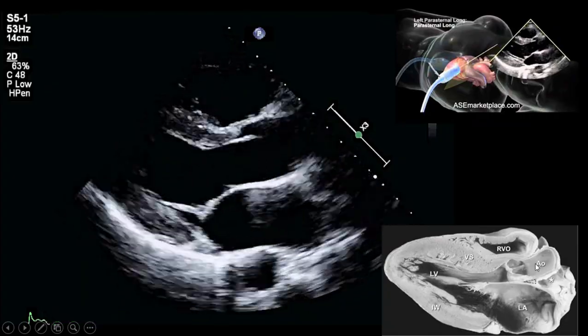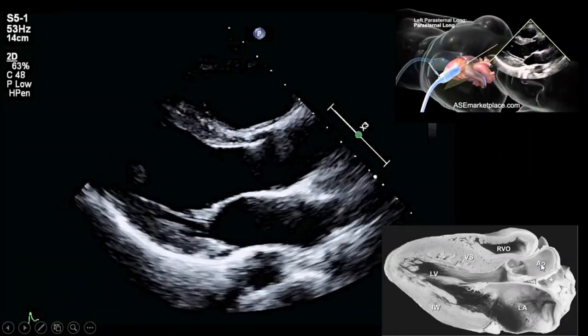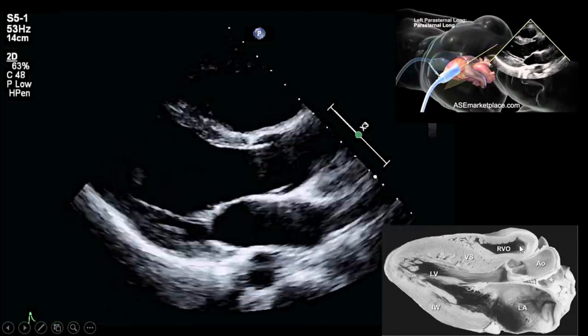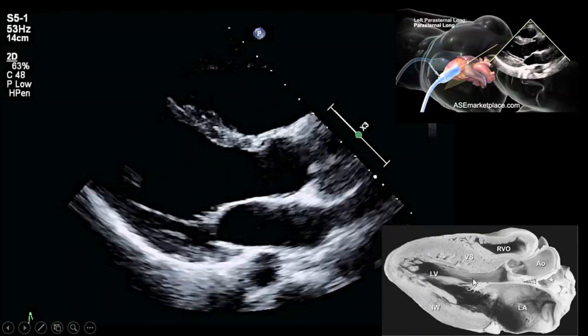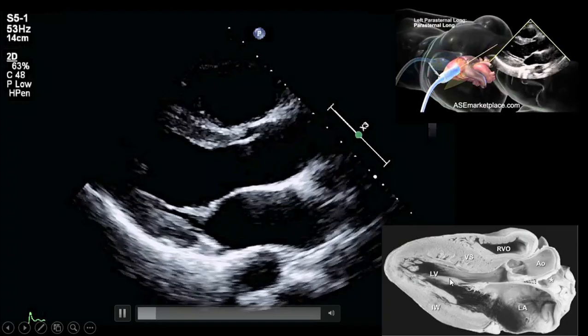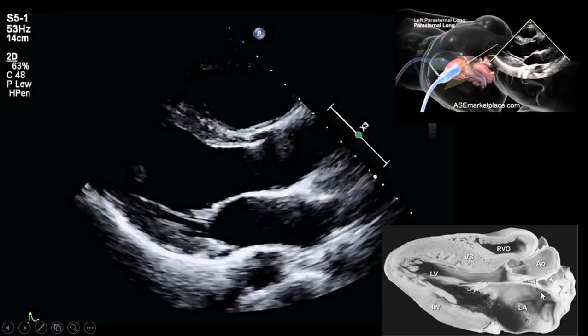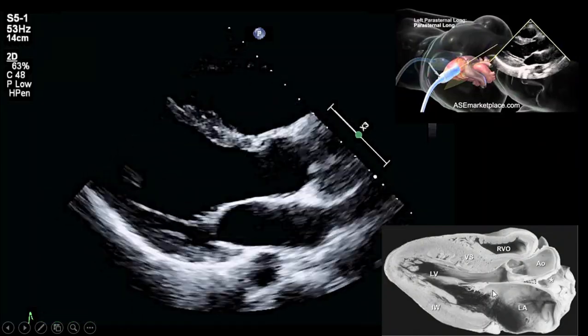In this photo, the camera creates an image of the wall of the aorta too, here the aortic valves, inside of the RVOT some trabeculation, the left ventricle, the internal wall of the left ventricle, or papillary muscle that is not at the level of the cross section, or the left atrium wall inside, and so on, and here the mitral valve leaflet.